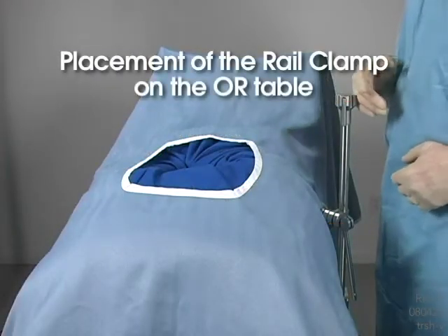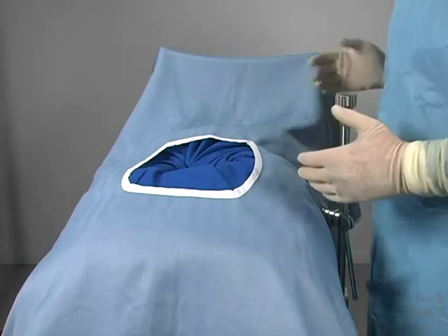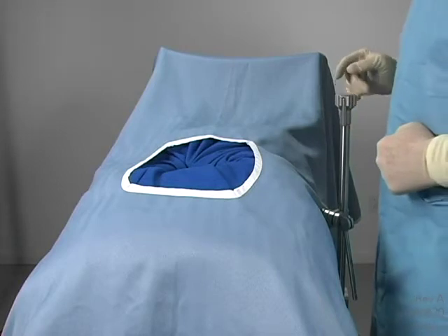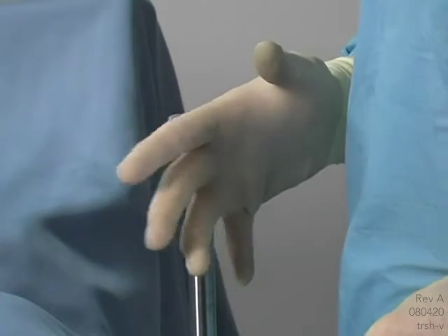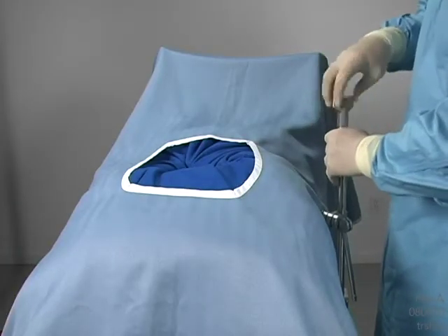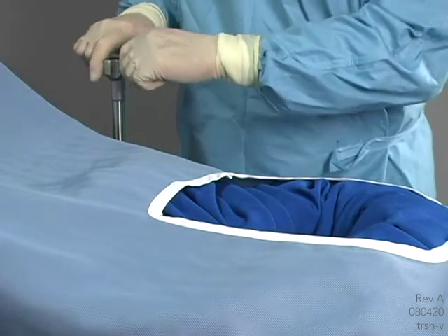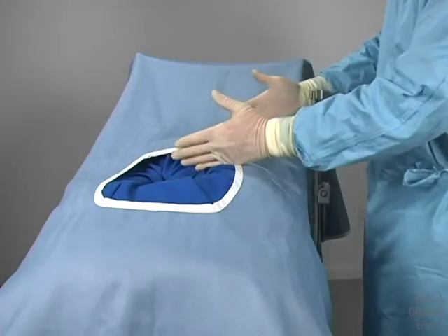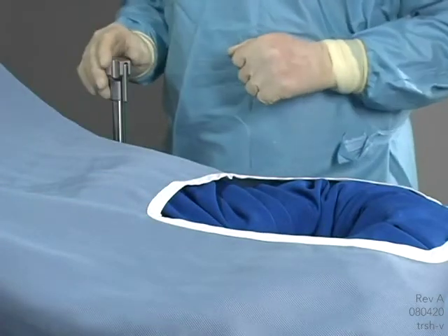Placement of the rail clamp on the OR table. Improper placement of the rail clamp can obstruct access to the operative site and inconveniently be in the OR team's way. It can also make it more difficult to set up the retractor frame. Therefore, proper placement of the Elite 2 rail clamp on the OR table is essential to efficient utilization. In most instances, the rail clamp should be placed on the OR table opposite the primary surgeon. A general guideline for proper placement is 8 to 12 inches above or below the incision.